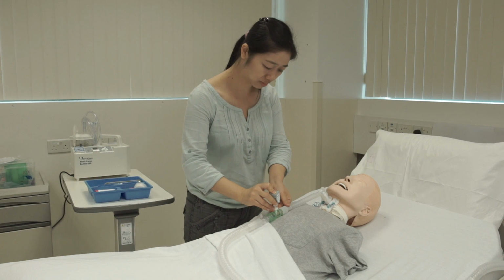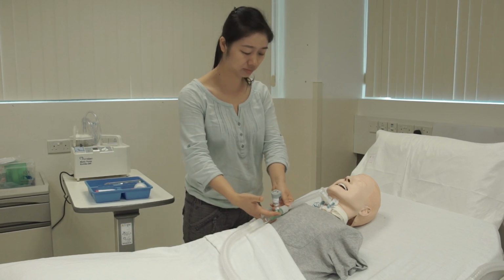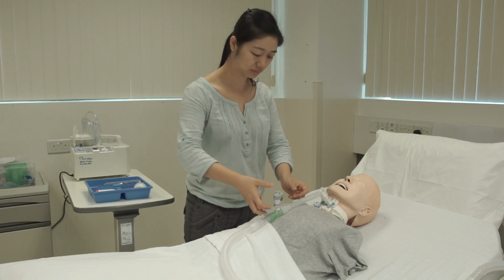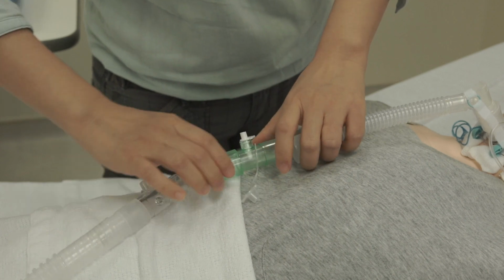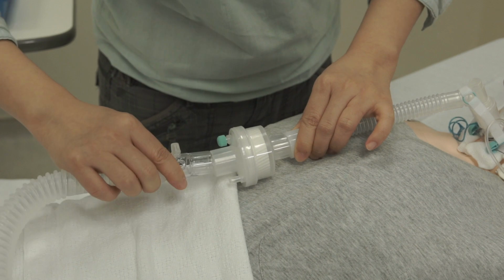If the patient can coordinate, ask the patient to breathe in and puff the inhaler at the same time. Otherwise, puff the inhaler when the ventilator delivers air. Remove the connector and replace it with HME.